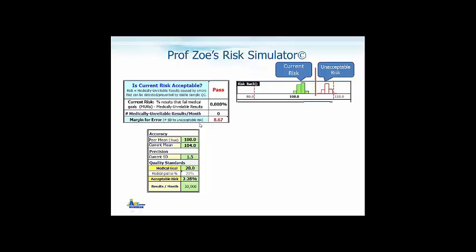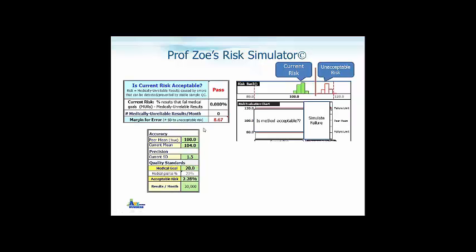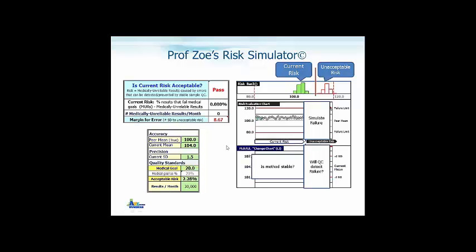And again, the question is, can you draw the line? This is a really good method. Well, you see a risk evaluation chart that answers the question, is this method acceptable? So it again shows the true value and the allowable error limits. And as long as all your results here are within your medical goals, the method is acceptable.